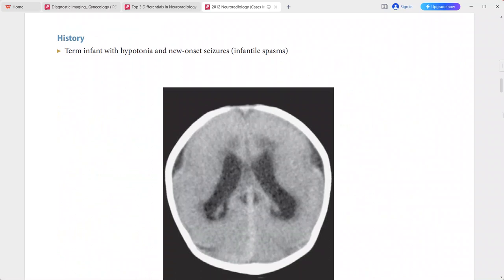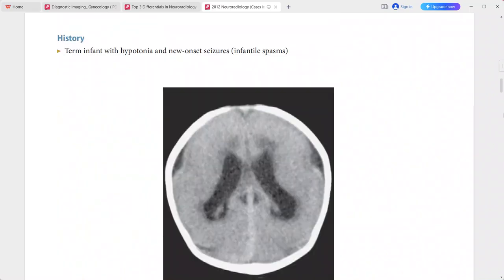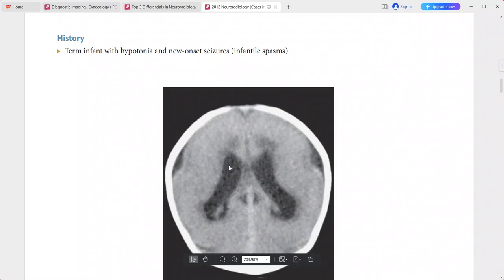Next: a term infant presenting with hypotonia and new onset seizures. Non-contrast CT shows an abnormally smooth brain surface with near complete absence of normal sulci. T2-weighted MRI confirms the abnormally smooth brain surface.